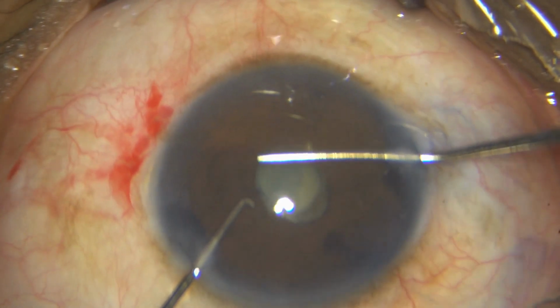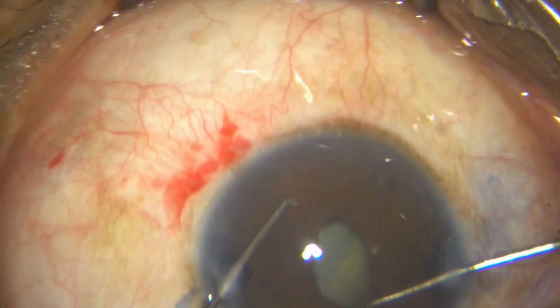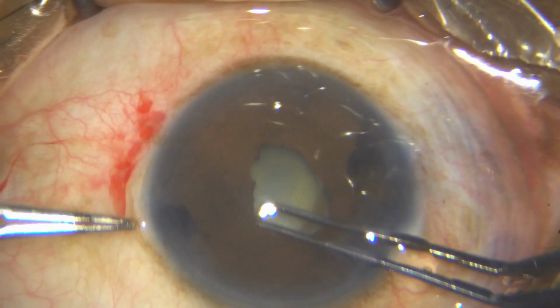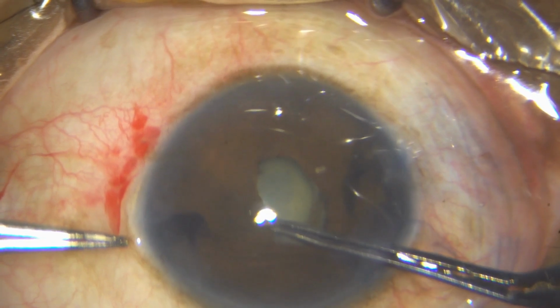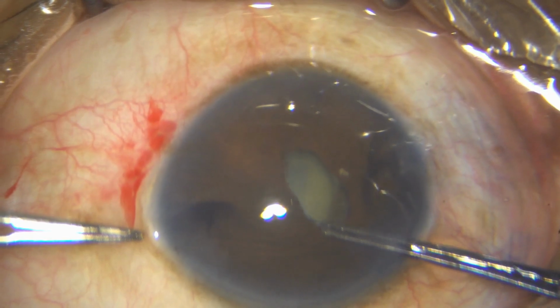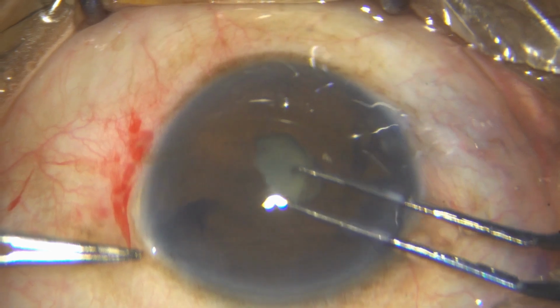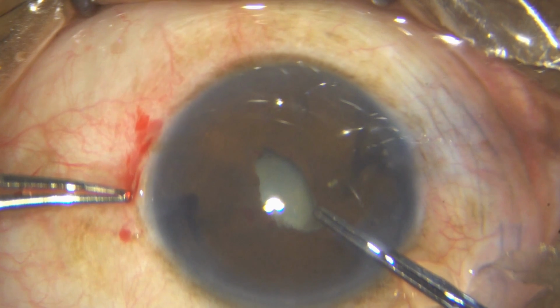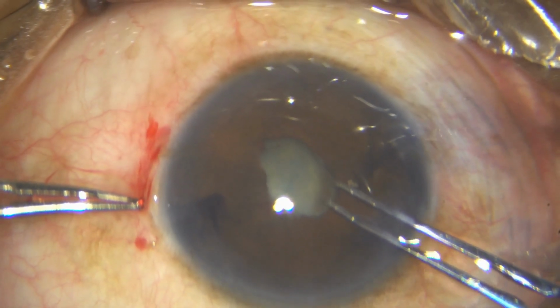So I've separated out the synechae, and now usually I pull off this fibrotic membrane. I try to tear it tangentially, but this seems to be pretty dense. So whatever I do, you can see it is putting a lot of strain on the root of the iris. So I really try hard to get a hold of this membrane and to tear it off, but it's just not giving way.